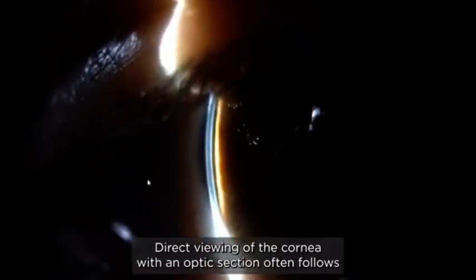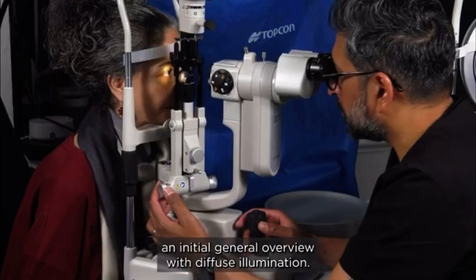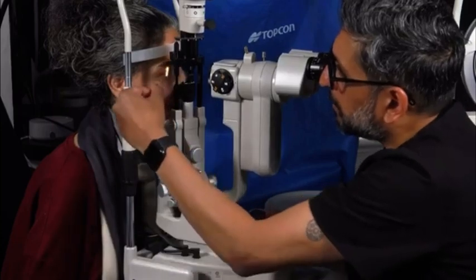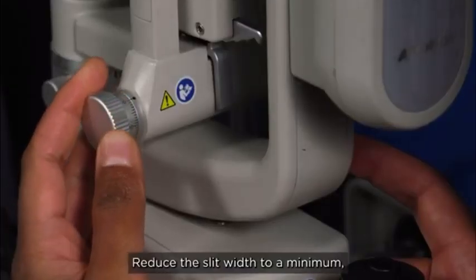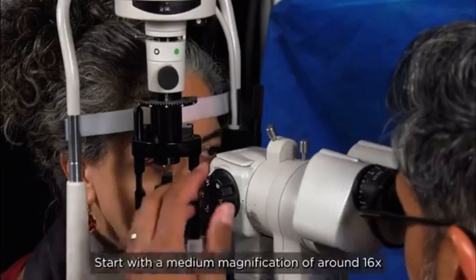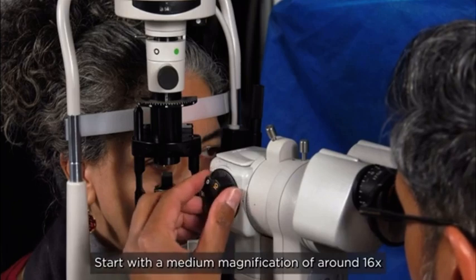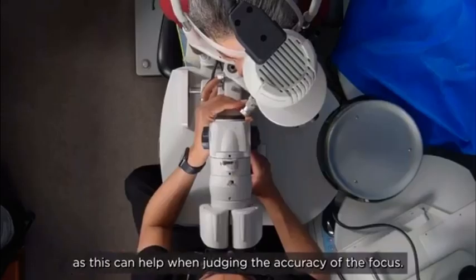Direct viewing of the cornea with an optic section often follows an initial general overview with diffuse illumination, so it is important to remember to remove the diffuser before you begin. Reduce the slit width to a minimum, but increase the brightness to compensate. Start with a medium magnification of around 16 times, as this can help when judging the accuracy of the focus.